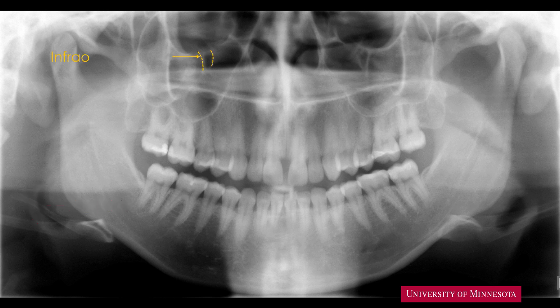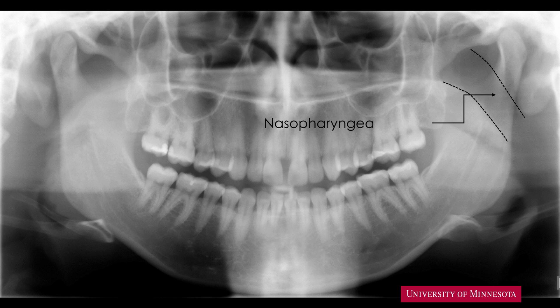Superimposed over the floor of the orbit are two radiopaque lines, almost parallel to each other — this is the infraorbital canal. On the posterior aspect of the border of the soft palate, there is a wide radiolucent band — this radiolucent band is the nasopharyngeal airway.